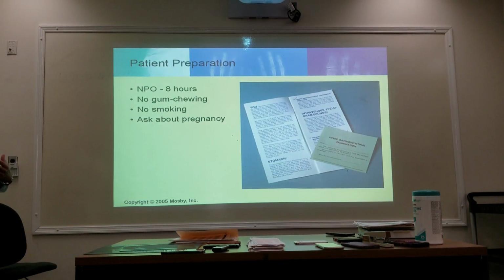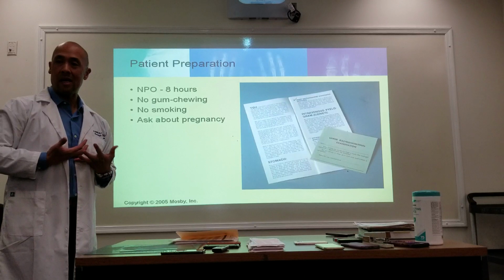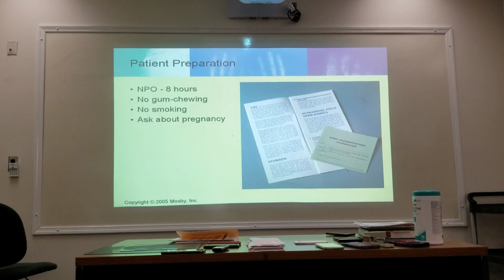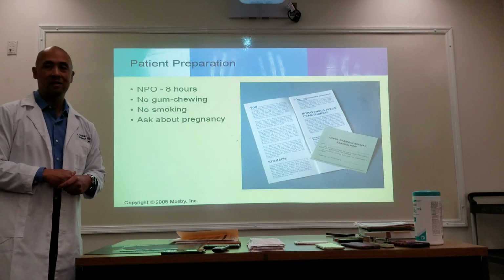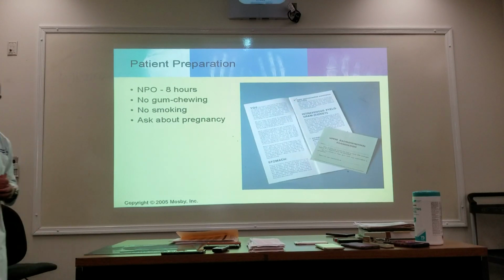But if there's a bra, I would remove the bra, especially if the patient may be hypersthenic, everything gets pushed up, and now you've got the bra, the underwiring, and maybe the clasp showing up on the X-ray. Any type of body jewelry. Don't have your patients wear pants. Sometimes I've seen technologists do these studies with the patient's pants on. Don't do that, because now you have buttons and zippers getting in the way.